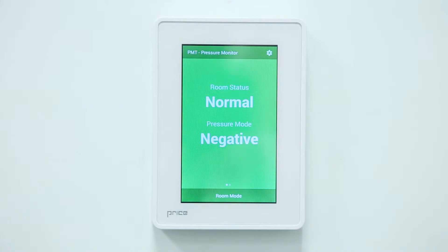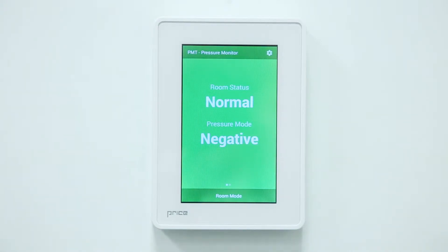Hello. Thank you for taking the time today to review the operation of the Price Touchscreen Monitor, or PMT, by Antec Controls. Before I begin, please note that the PMT is designed to monitor room pressurization and is not used for room pressure control.